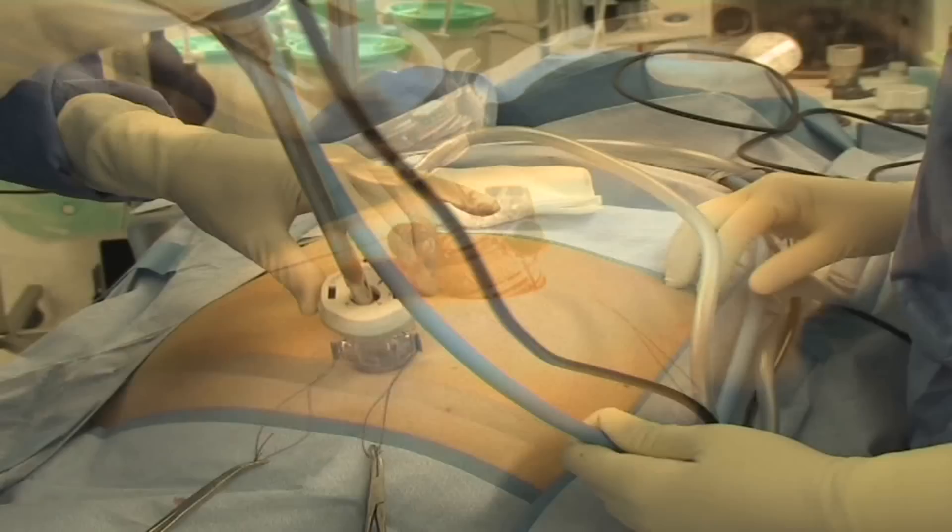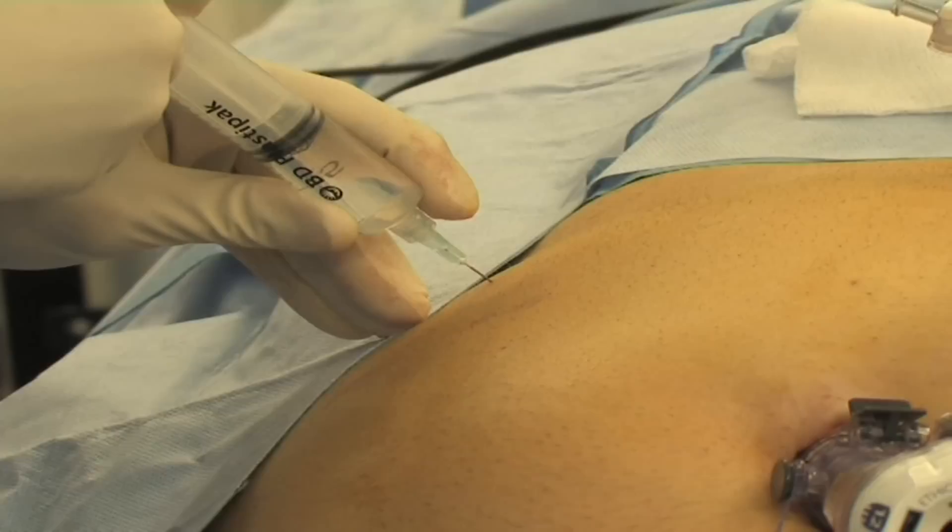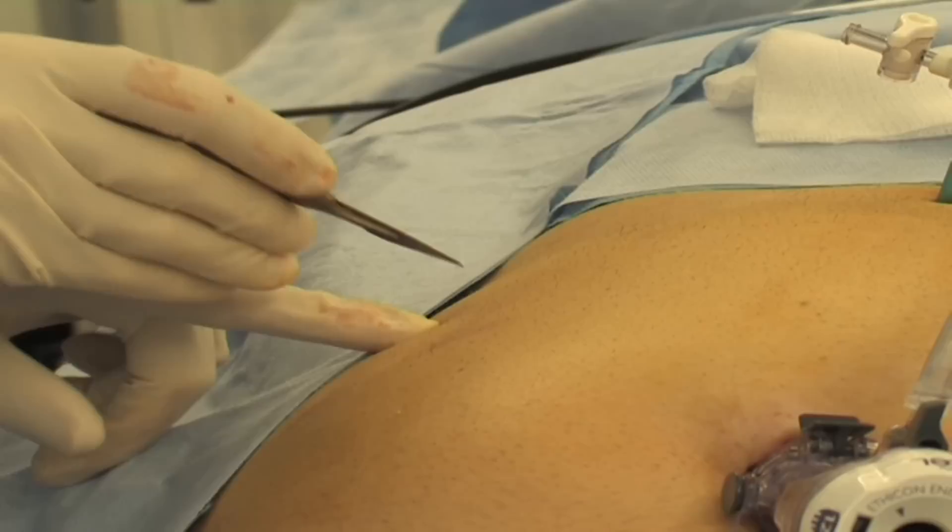A 10 mm fibre optic camera is inserted via this port and this gives an excellent view of the abdominal contents. Three further 5 mm incisions are made and ports are placed similarly through these incisions.